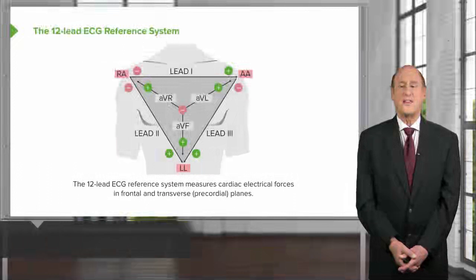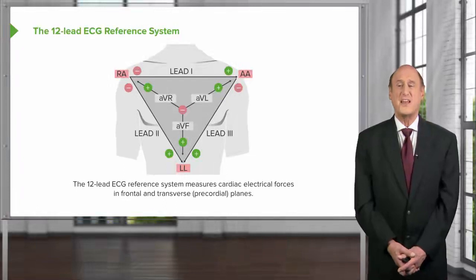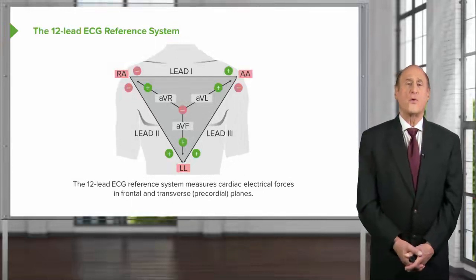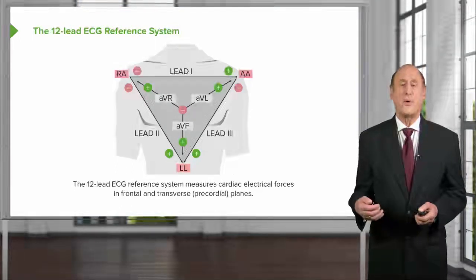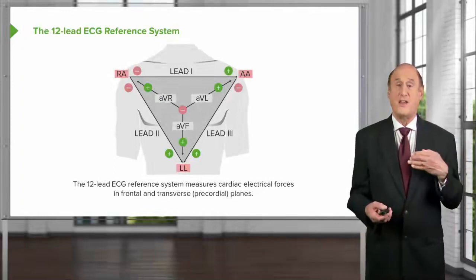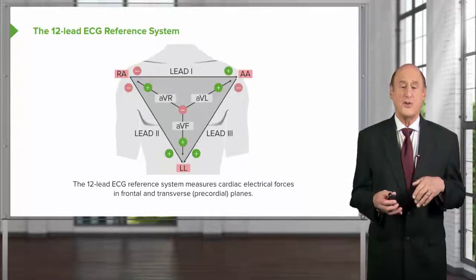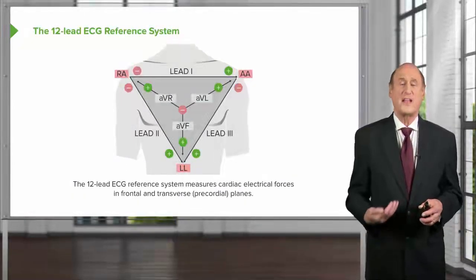So it turns out that by convention over the years, the EKG has come to have 12 different leads, that is 12 different points that are looking at the wave of depolarization going down through the heart. And the earliest ones from Einthoven were so-called leads 1, 2, and 3. These leads are all designated by the points on a compass, 0 to 360 degrees. Lead 1 is over here, and it's looking in at the heart from the left point, like the left arm in, and that is designated as 0 degrees. Lead 2 is looking from here, that's plus 60 degrees, and lead 3 is looking from here, that's plus 120 degrees.